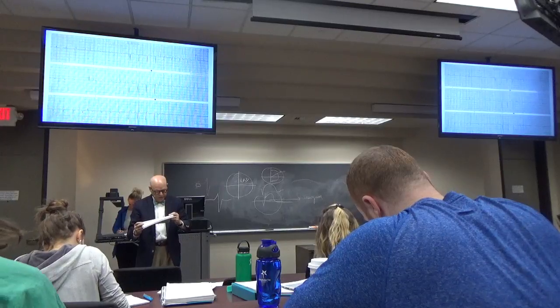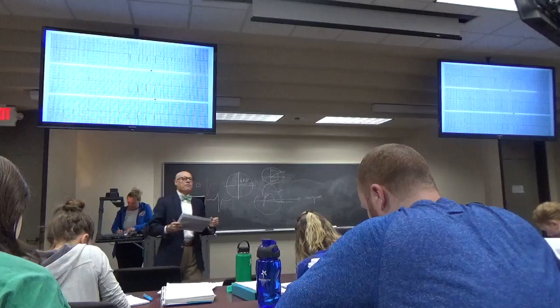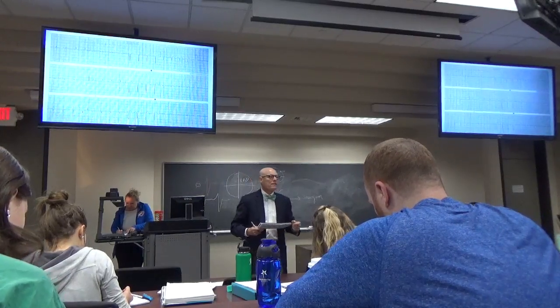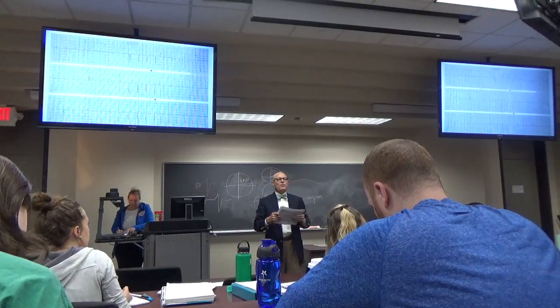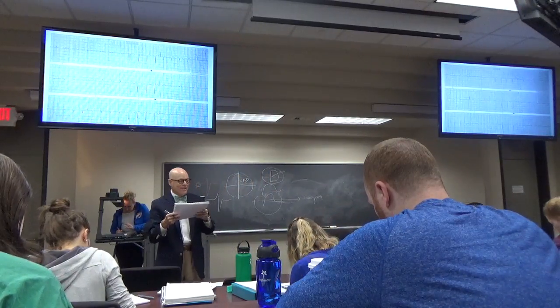And how about 2, 3, and F? Inferior infarct? How many called there an inferior infarction? How many did not? So this is a really hard one, right? Because there's a tiny little R wave. If you look really, really hard.